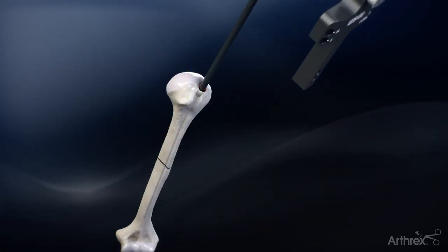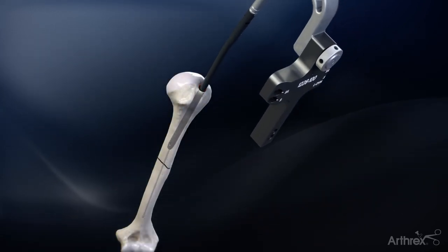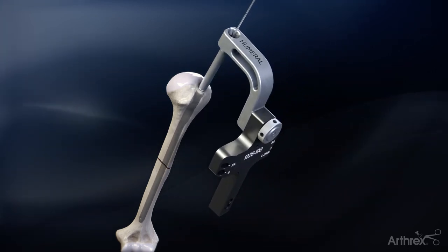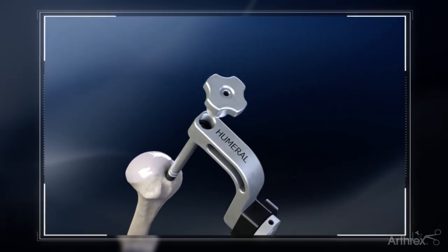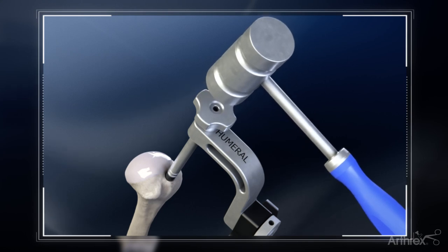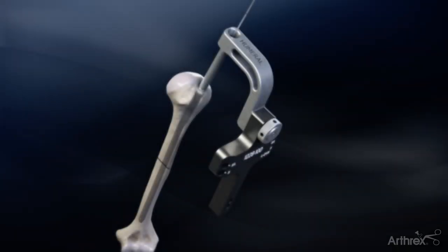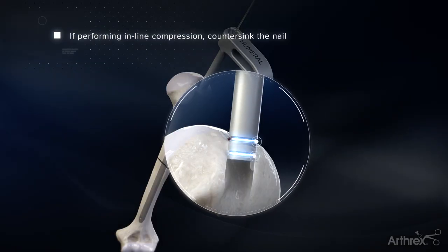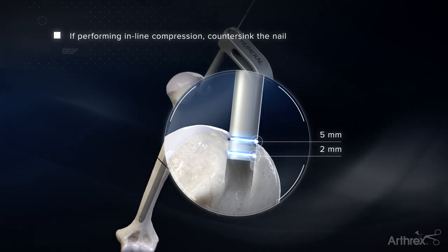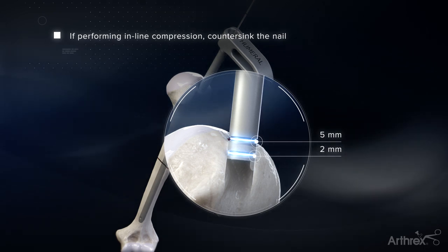Insert the nail over the guide wire into the entry portal. Gentle rotations may be necessary to fully insert the nail. If insertion proves difficult, thread the impaction pad onto the top of the targeting arm and use a mallet to advance the nail. Depth markings at the end of the targeting arm will help show the depth of the nail on a radiograph. The first line is 2mm countersunk and the second line is 5mm.